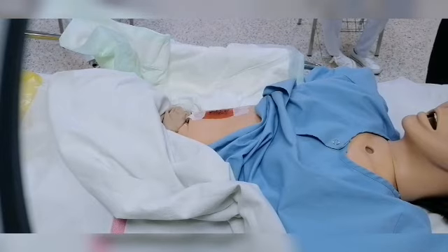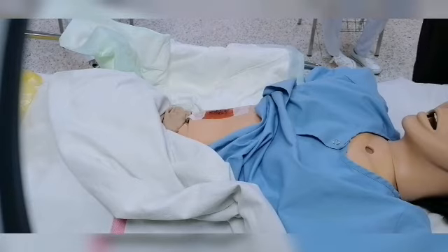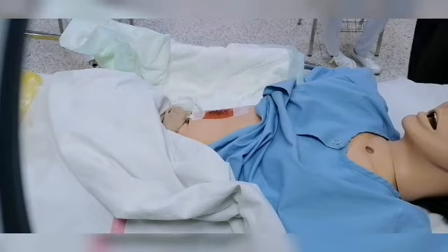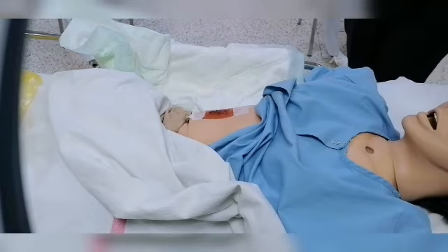We can sometimes use the non-touch technique, for a simple wound, even without wearing the gloves. But in this case, we have to arrange our equipment. We have to touch the forceps from just the end, which is away from the cotton side that we are using. We will use it during that.